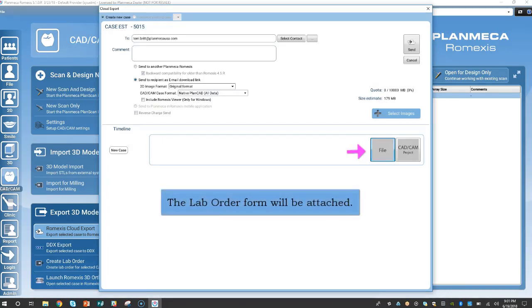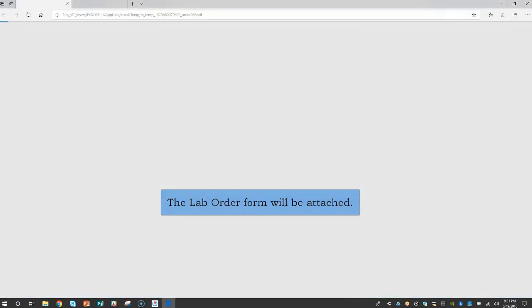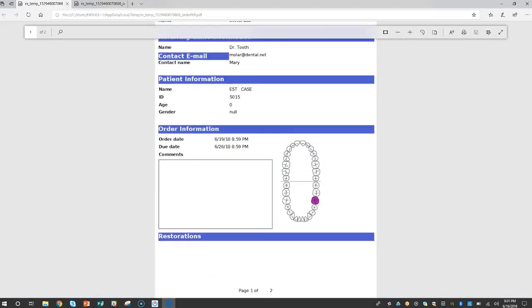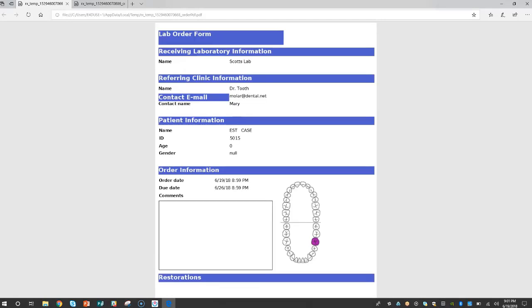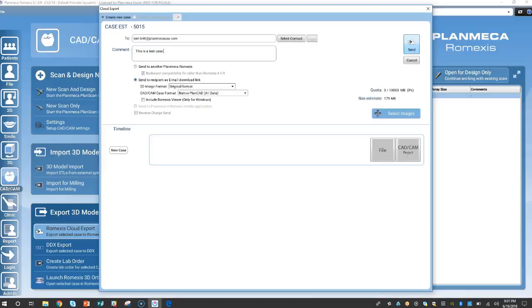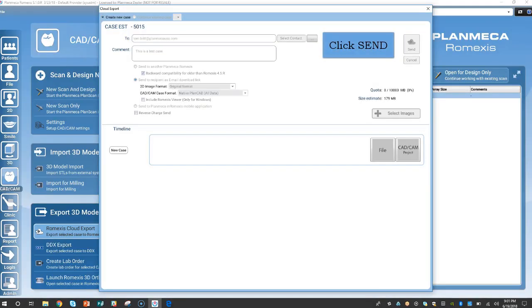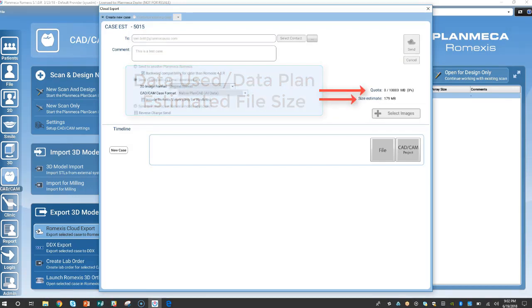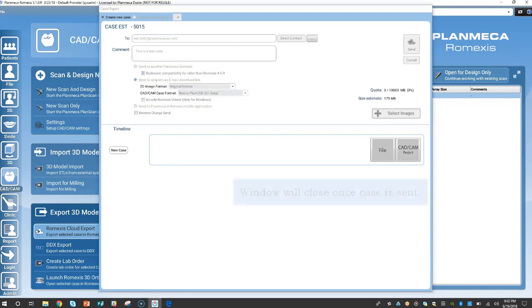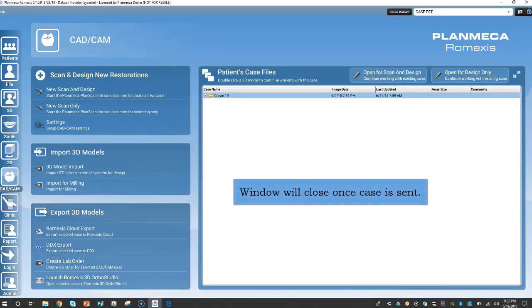To view, double click the file. Click send. Here is the data used out of your data plan and the estimated file size. The window will close once the case is sent.